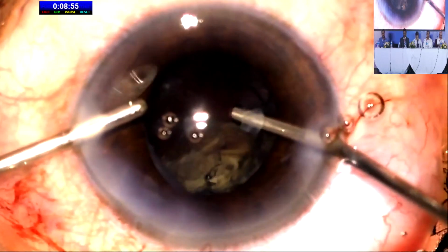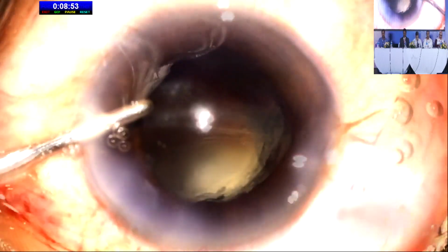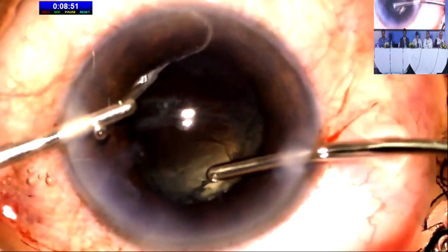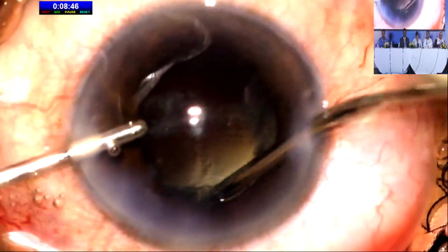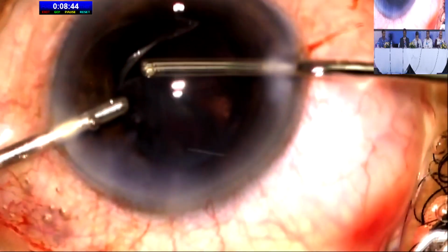A viscofluid exchange is performed prior to swapping the hands, prior to removing the rest of the cortex. I then proceed with the removal of the rest of the cortex.